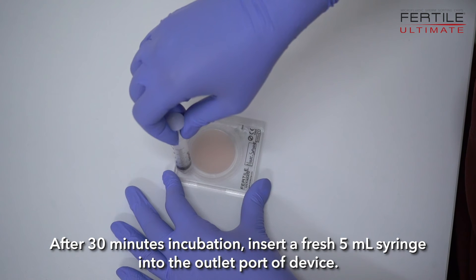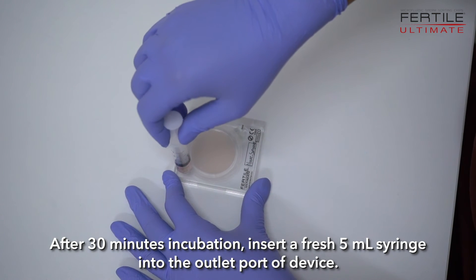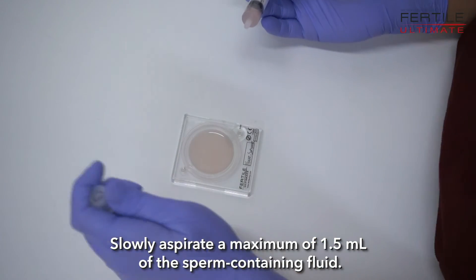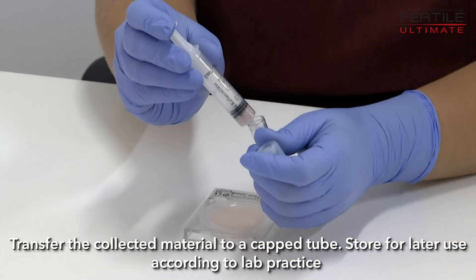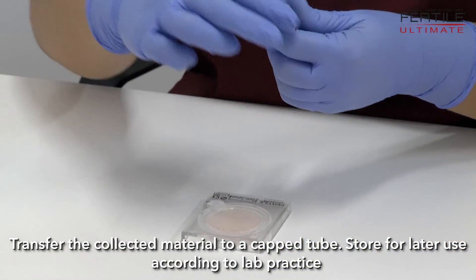After 30 minutes of incubation, insert a fresh 5 mL syringe into the outlet port of the device. Slowly aspirate a maximum of 1.5 mL of the sperm-containing fluid. Transfer the collected material to a capped tube and store for later use according to lab practice.